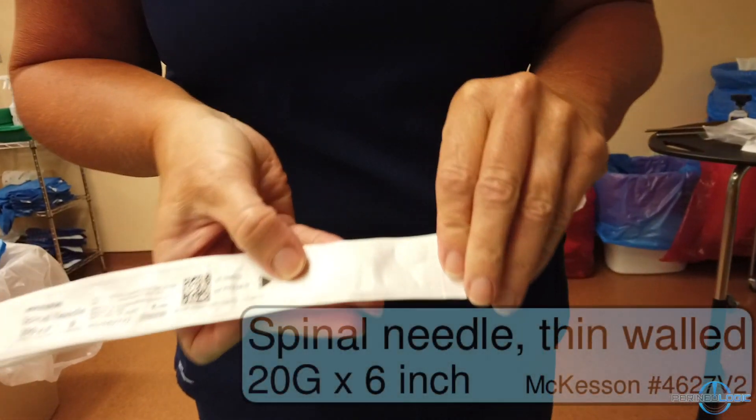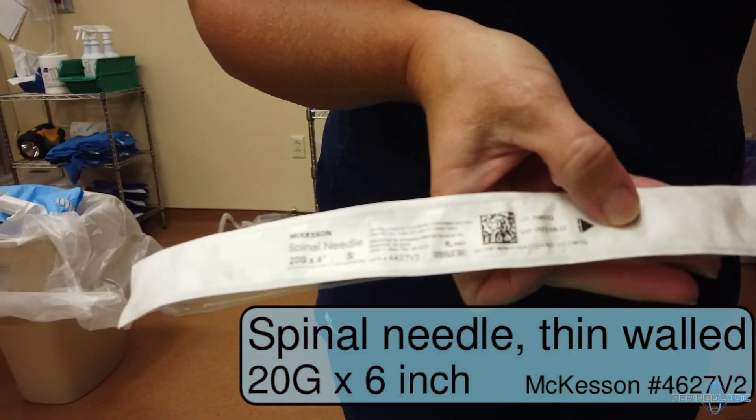Next is the spinal needle — thin walled, 20 gauge and 6 inches.